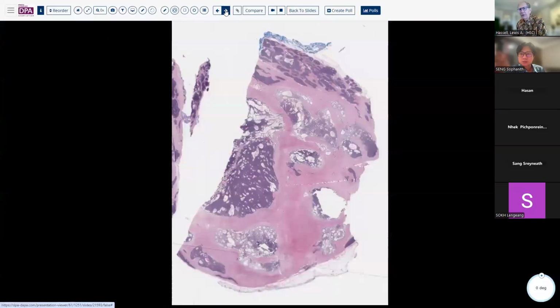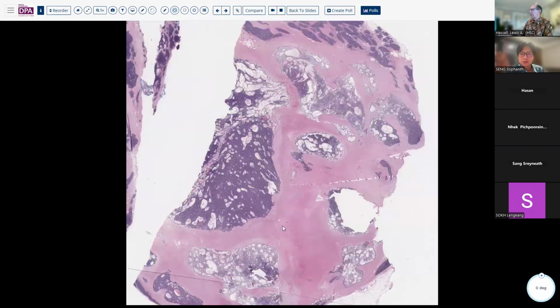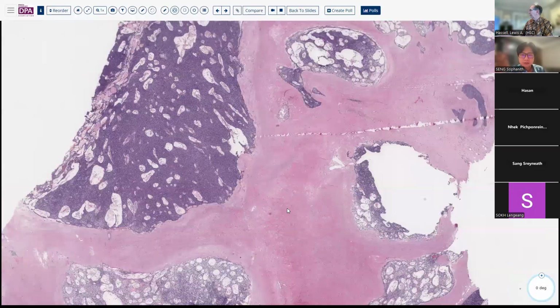Okay, well, finally, we come on to the neoplasms in the thymus. And we'll spend the bulk of the rest of the time talking about these lesions with a few others of the differential consideration. But here at low magnification, this illustrates some of the things you should be seeing. Dense fibrous bands are a hallmark of thymoma, and this is no exception. These are very accentuated fibrotic bands surrounding this tumor.